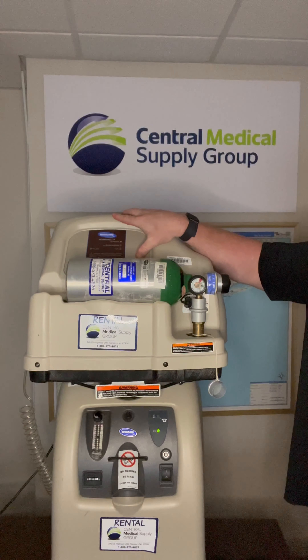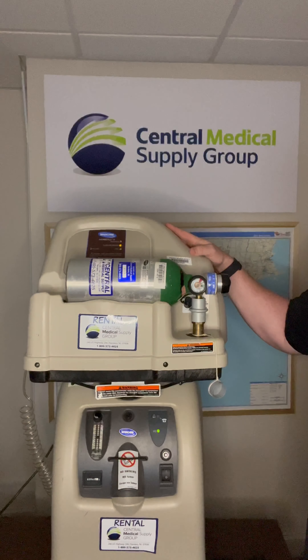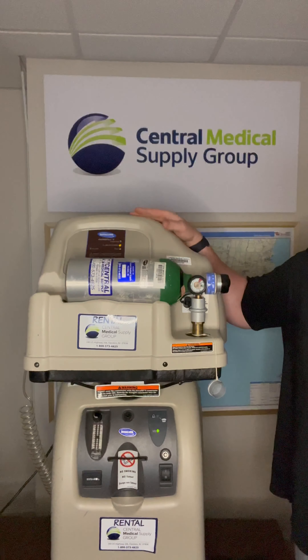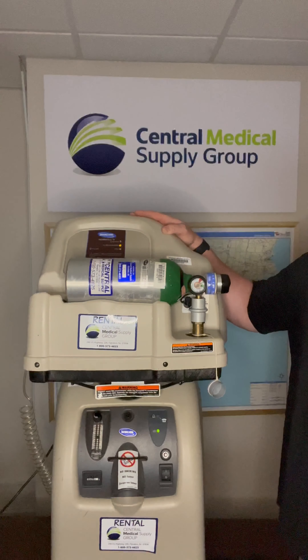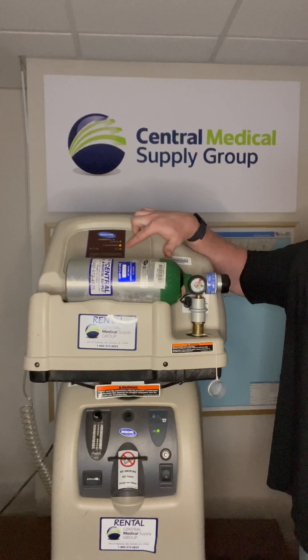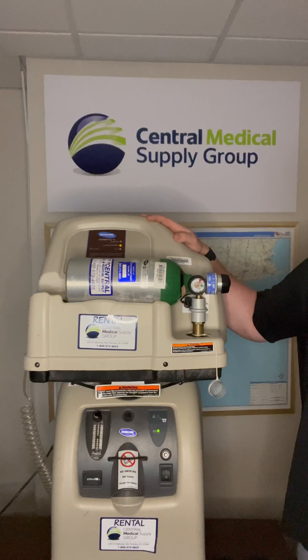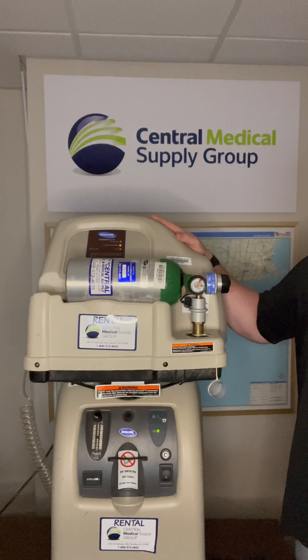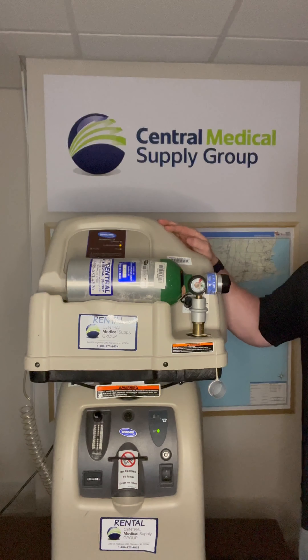Turn on the home fill system compressor unit. The unit may make a test tone noise momentarily, and you will hear the compressor start to run — this could take up to a few minutes. An amber yellow light next to 'Waiting' or 'O2 Below Normal,' depending on your model, will illuminate while the compressor prepares itself. After a few minutes, the amber light will turn off and the green filling light will turn on. When filling is complete, the green light next to 'Full' will turn on and the compressor will turn off.